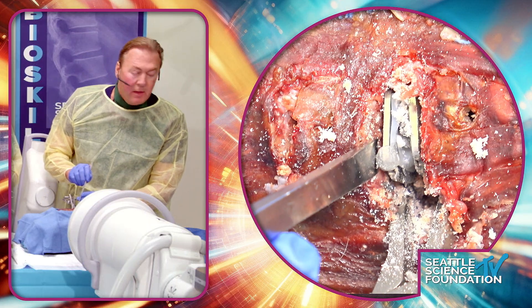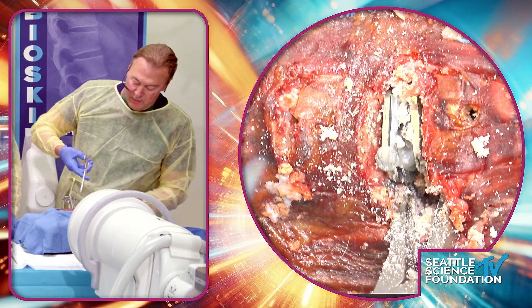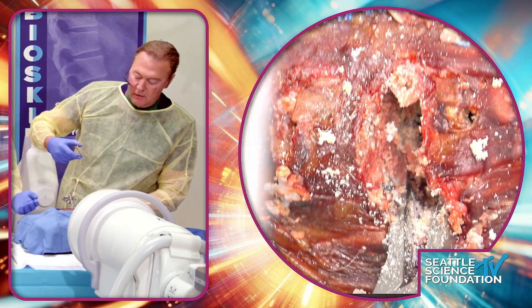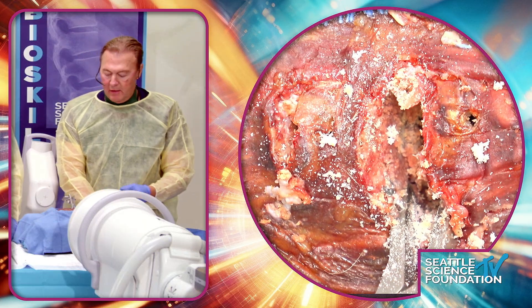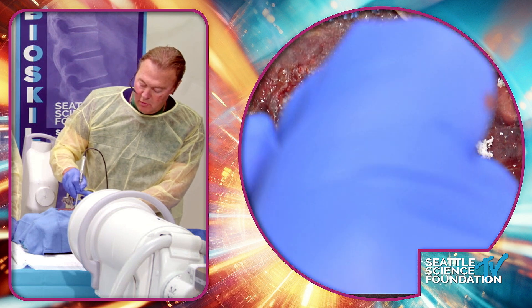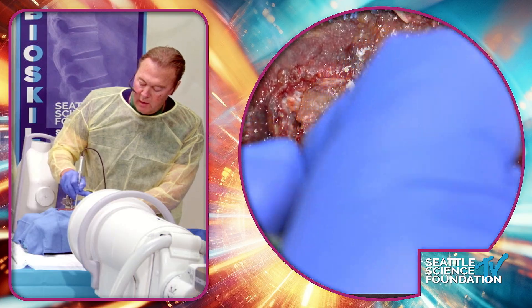Get a fluoro shot and you'll see you want to just get right under that end plate and lift as you drive the chisel. Once you've done that, take a needle holder, grab one of the end plates, and it'll slide out — now that there's no dome. Take out the superior, then grab the inferior and take that out. You've got your space and can then use the spreader to do further decompression. This is a bit of a domed end plate, so I might create a more parallel end plate for the revision.